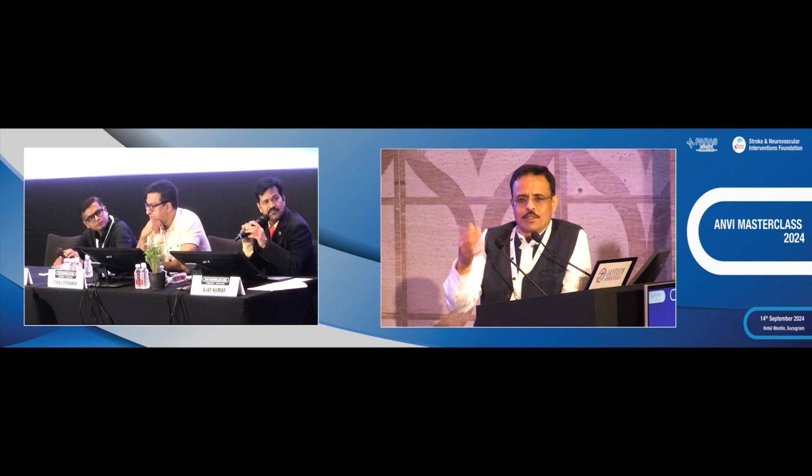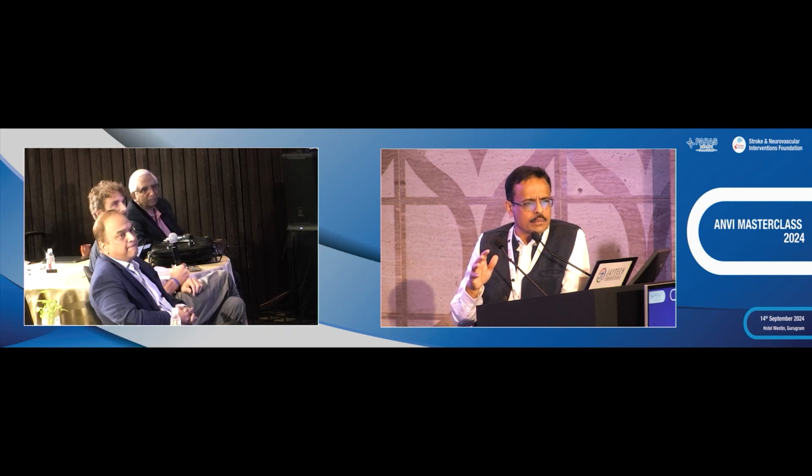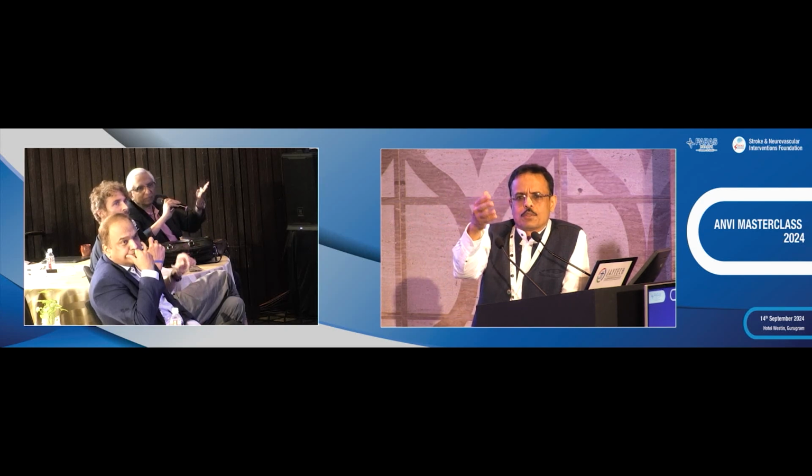Vincent, balloon mounted or self-expanding? Why not a simple balloon? We did a simple balloon, it occluded. Simple drug-coated balloon, it was occluding with the balloon angioplasty. He said it was not staying open. So what Vincent is saying is, balloon mounted stent or self-expanding, what would you use?